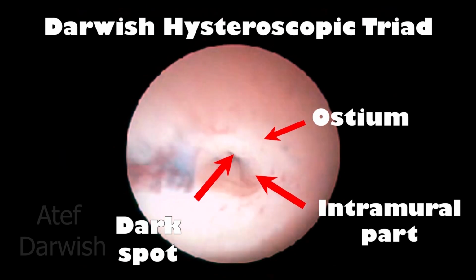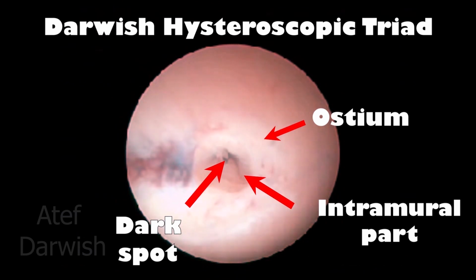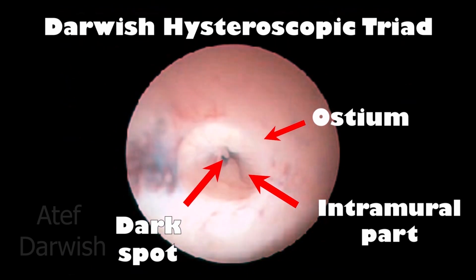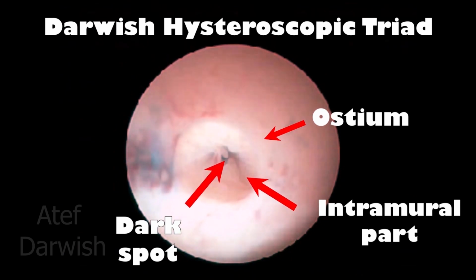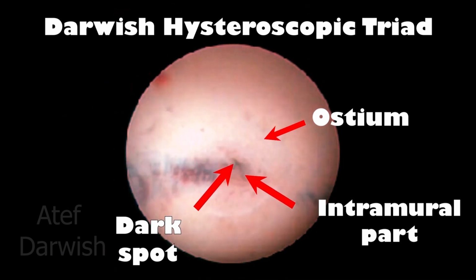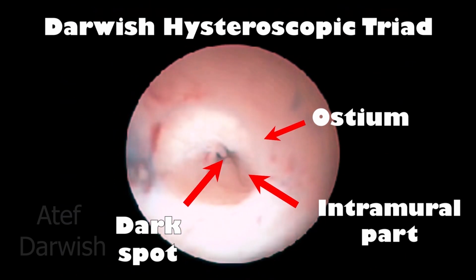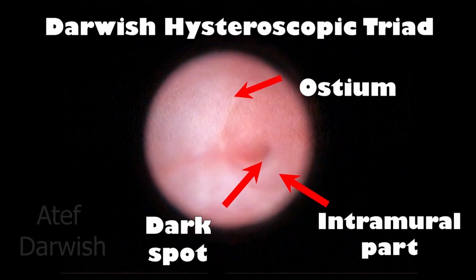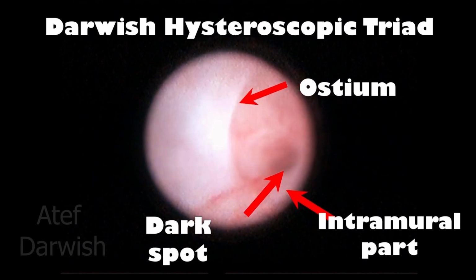Here you can see the arrows demonstrating the ostium as a wide fine outer ring, and a dark pinhole spot inside this cone, representing the tip of the cone, and the walls are formed of the intramural part of the fallopian tube. These videos are taken from infertility patients when evaluating the endometrial cavity during hysteroscopy.